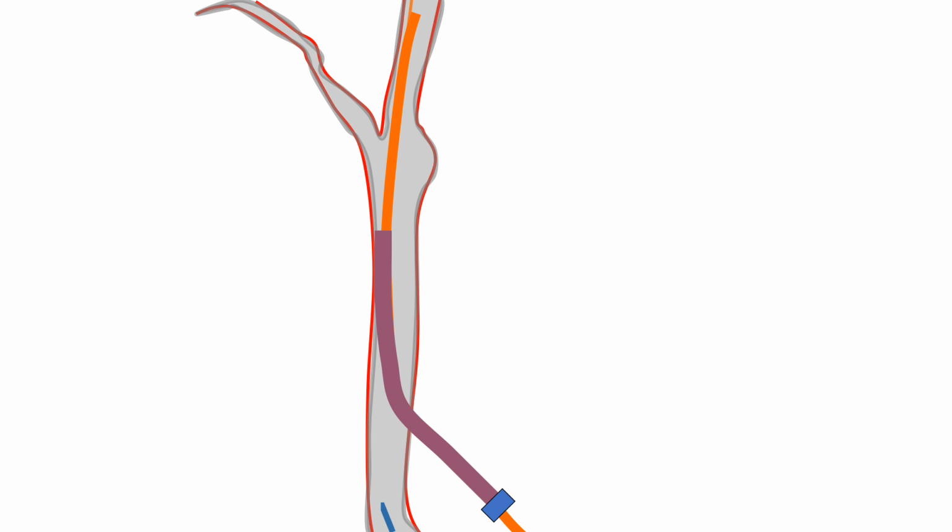Whether you want to take a Neuron or a Navion or just a guiding catheter, whatever happens, you can take it up. Once you're taking that to the target site, tape that also to the skin, because when you're going to work quite far off, you will not see what's happening in the neck. Things will kick out, and you will find you have a huge hematoma in the neck. So remember, in the neck, everything has to be taped, everything has to be fixed, so nothing moves.